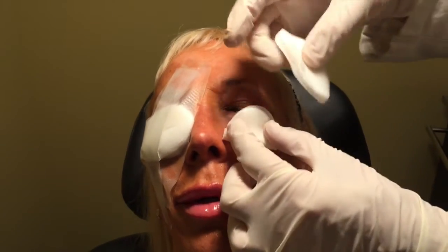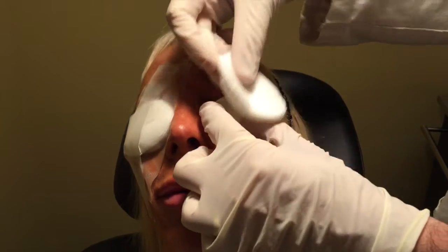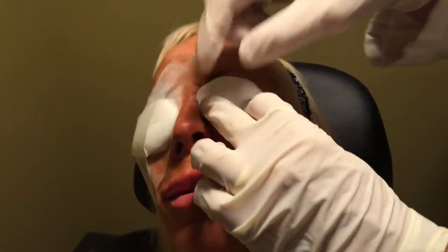I'm going to take two eye pads. You're doing great. And we're going to fold it over so it's starting to put pressure on this region, and then we're going to put a second one on top of it. And here's our first bit of tape.